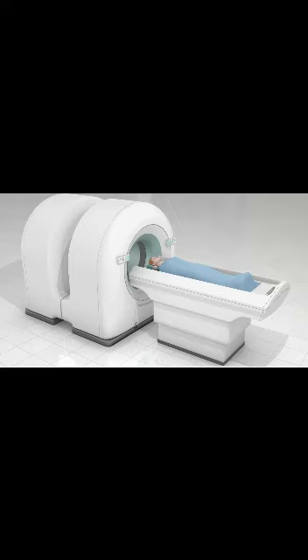What is a disadvantage of a PET scan? Limitations of a PET scan: a PET scan is less accurate in certain situations. Slow-growing, less active tumors may not absorb much tracer. Small tumors, less than 7 mm, may not be detectable. High levels of blood sugar can cause the cells to absorb this normal sugar rather than the radioactive, injected kind.